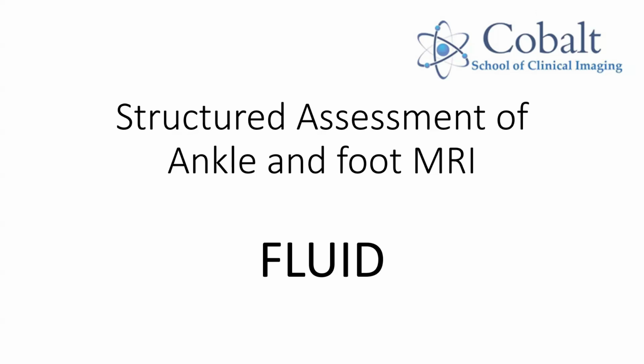I think what's being asked is, can the MRI tell us that healing is pretty good, don't worry, it's all going well. Certainly MRI will tell you after repair that there's no gap. It'll never look a normal black signal, but we don't expect that to happen.